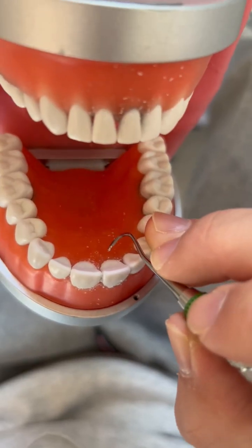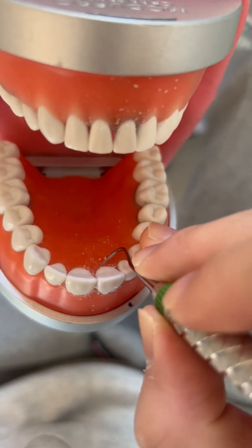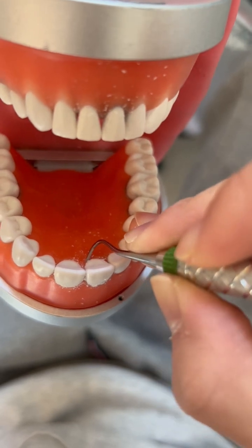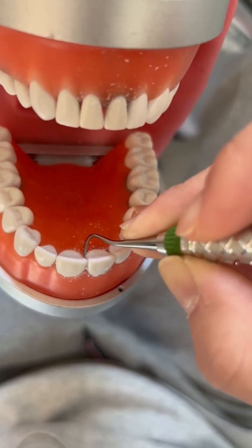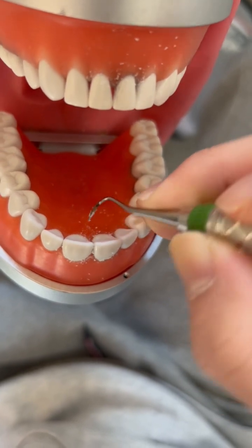Now I'll go towards the linguals using the opposite blade, the secondary blade. Stand tall, start at the midline, side to side, pivot and roll, side to side, pivot and roll. Only go half of the interproximal space.